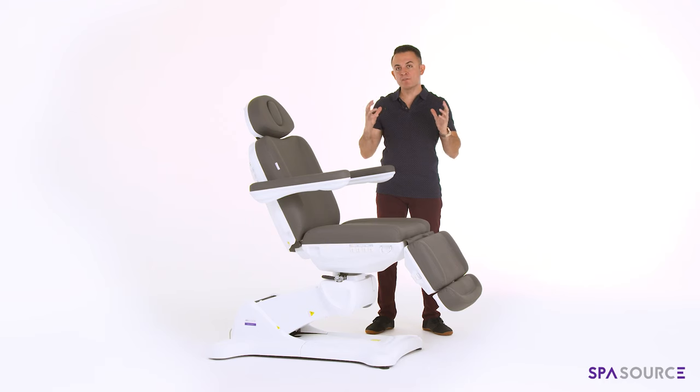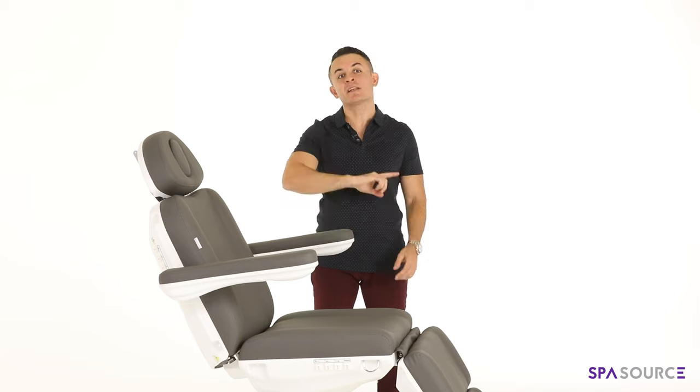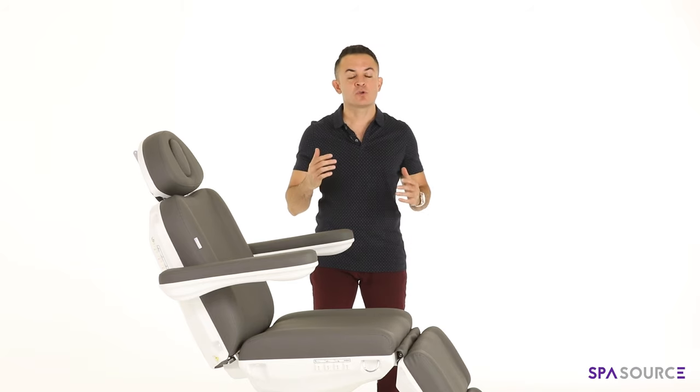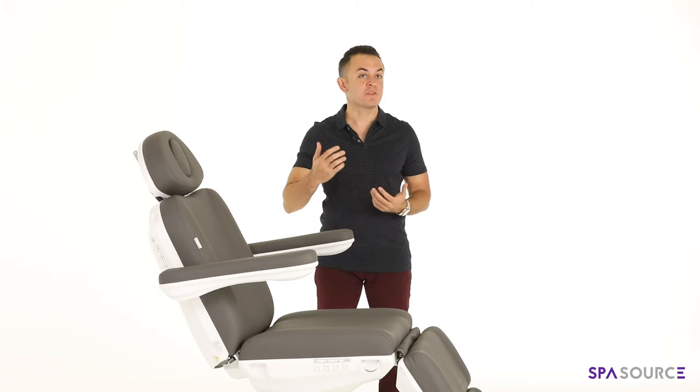In addition to that, we use the best polyurethane PU upholstery on our chair and across the rest of our lineup, so it actually fully breathes and it's very comfortable to the touch — very plush.